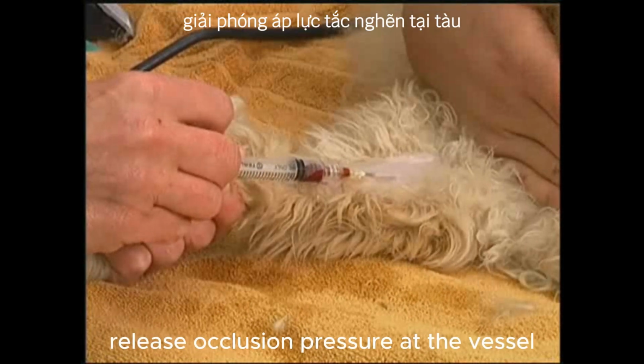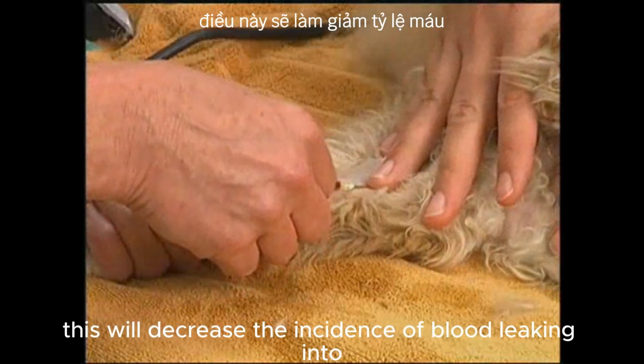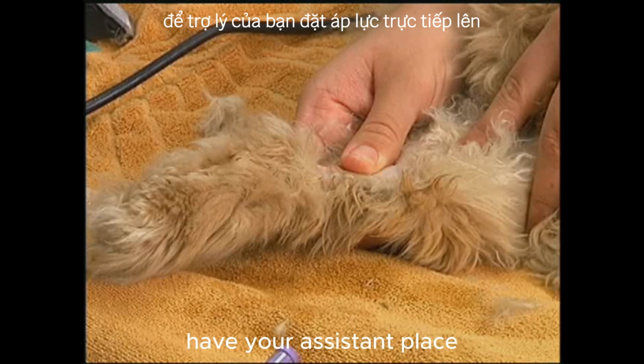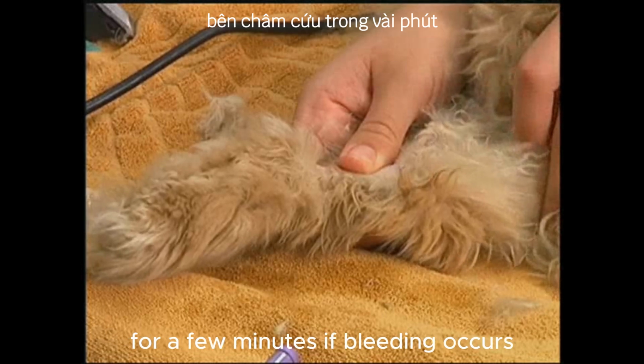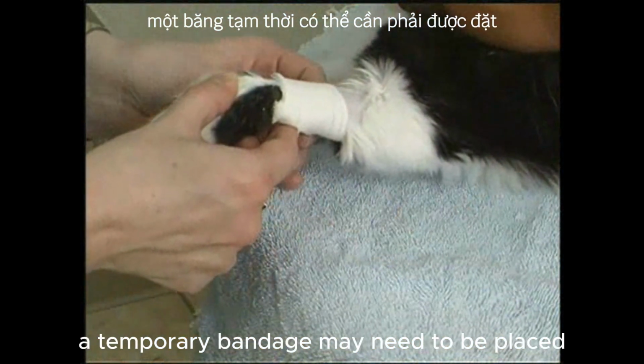Release occlusion pressure at the vessel before retracting the needle. This will decrease the incidence of blood leaking into the tissues from the punctured vessels. Have your assistant place direct pressure over the venipuncture site for a few minutes. If bleeding occurs, a temporary bandage may need to be placed.